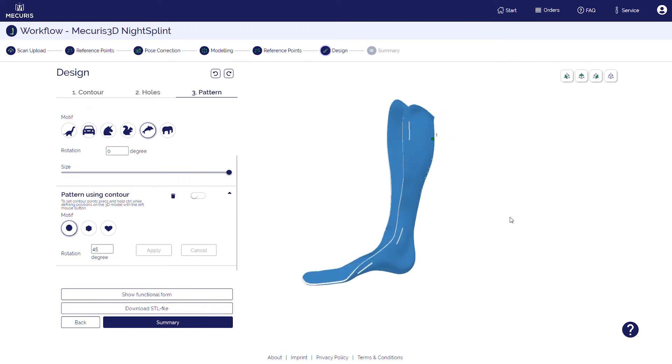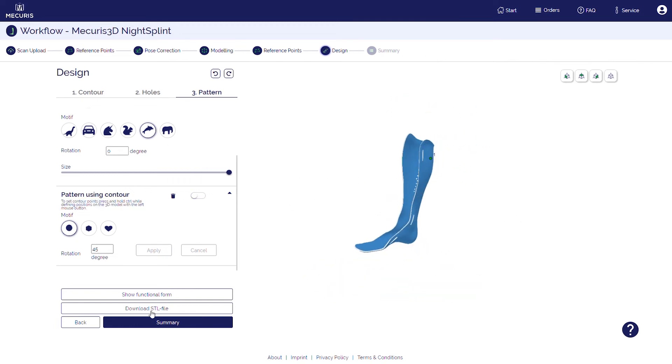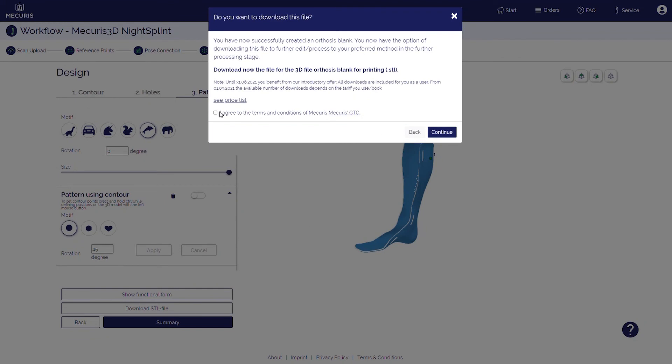Once you're all set, you can download a 3D CAD file of your orthosis and have it printed by your 3D printing supplier, or by using your own 3D printer.